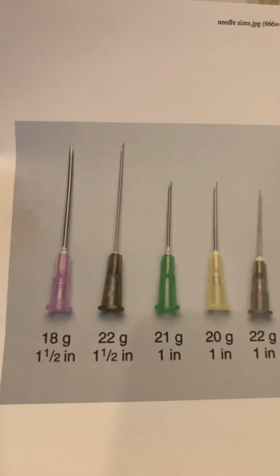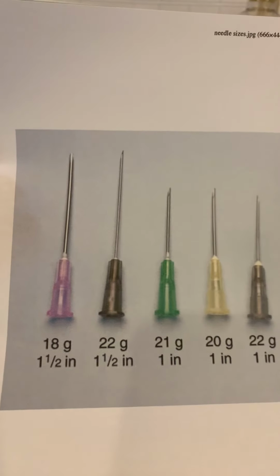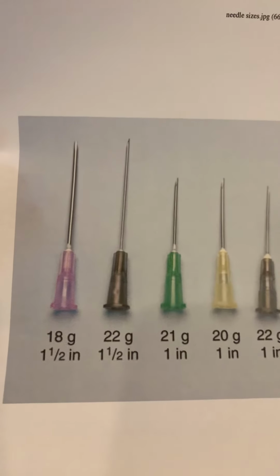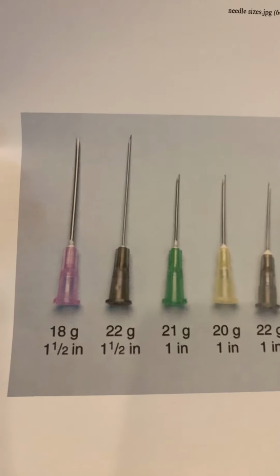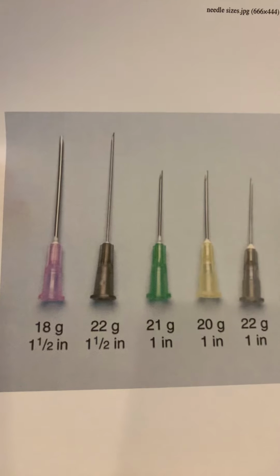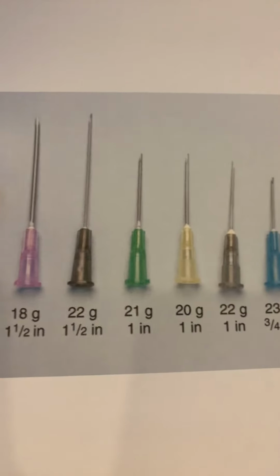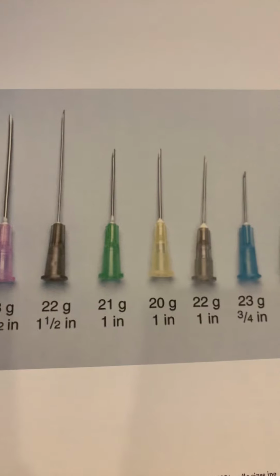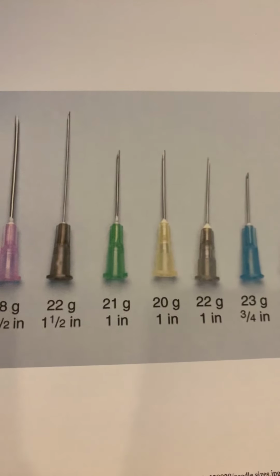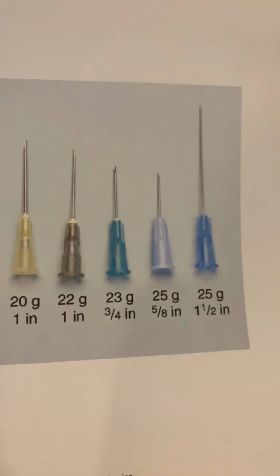This picture here are your gauges. That's how wide the needle is. So an 18 gauge is something that you would not use for an injection. It'll be used more for pulling up medication. So a 22 for an adult, 22 gauge is fine. There's a 21 gauge. You can see there's different lengths, but this is the gauges, how wide those needles are. 21 gauge, 20. Okay, and as you go all the way down to 25 is very fine.